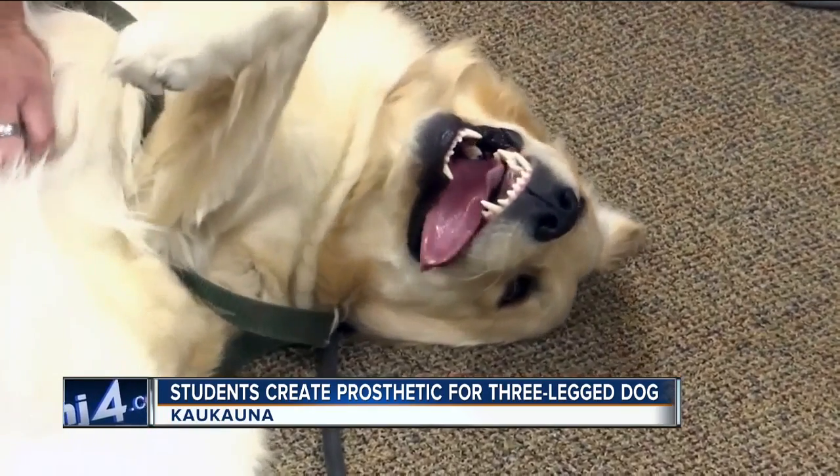We have a new puppy at our house. The trainer was telling us about Gray, and I just kind of casually said, 'Oh, we've got a 3D printer. We can do something with that dog.' And that's how we got going.